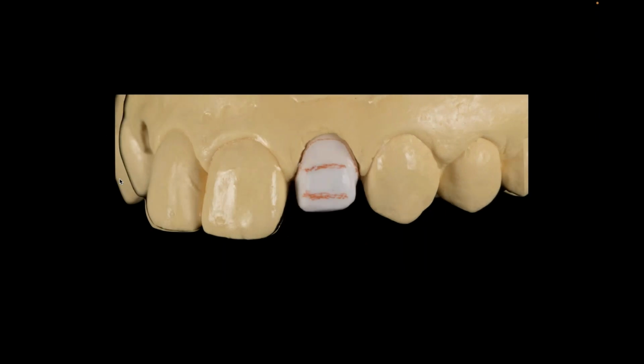The refractory die slips in and out very nicely, so I have something to work on. And you can see how much of a space I actually had here. This is why I regret that I didn't stop the case here and opt to put a window veneer on the cuspid. But she was very happy and it worked out.